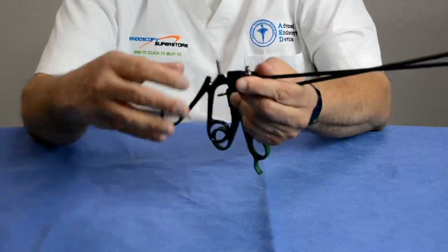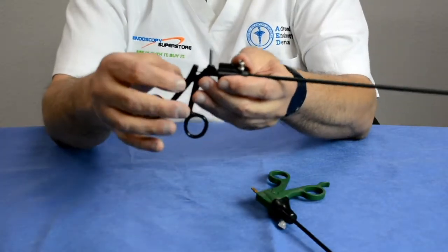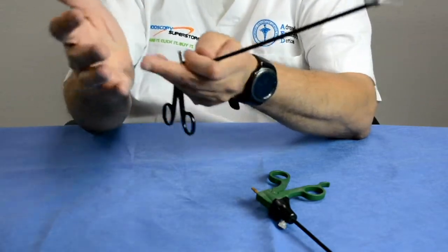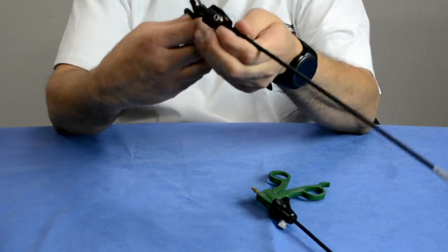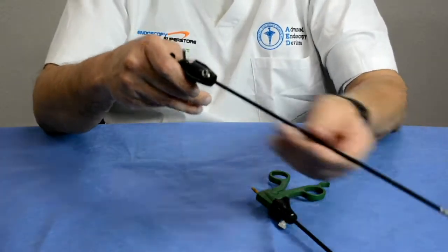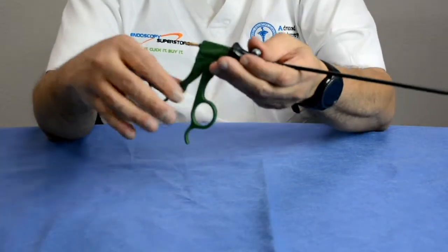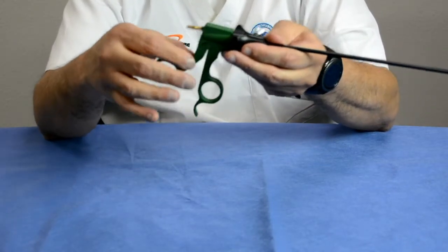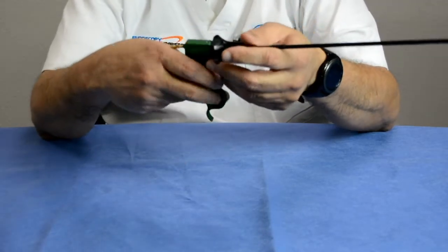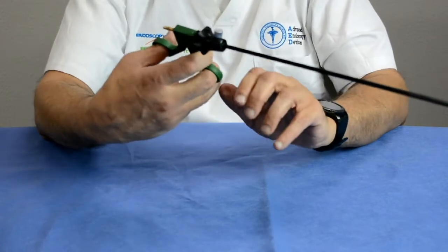The original instruments had stainless steel handles that were coated. When being used, the coatings on the handles would wear out. When current was applied, it would pass through the handle and sometimes arc on the doctors' hands because the insulation was compromised — the energy could be stronger at the handle than at the tip. So the next generation of laparoscopic instruments used composite handles, made out of polycarbonate, carbon fiber, or other materials, fully insulating the doctor from getting shocked during procedures.